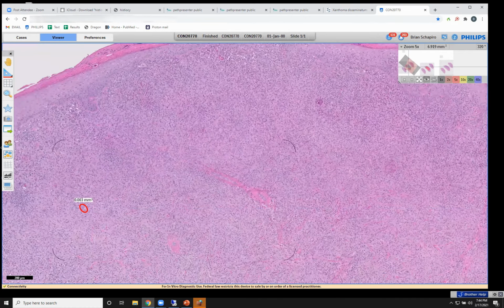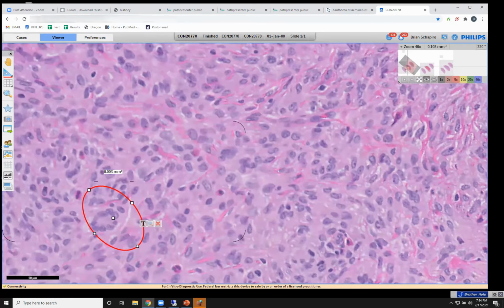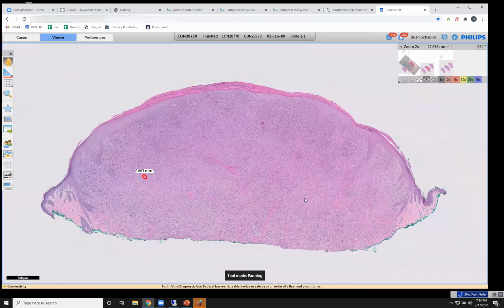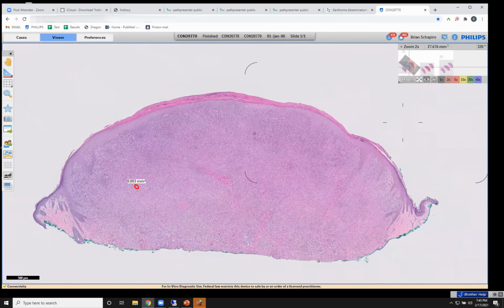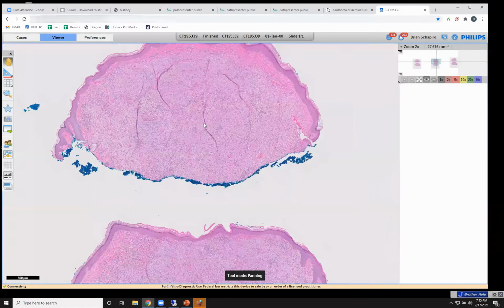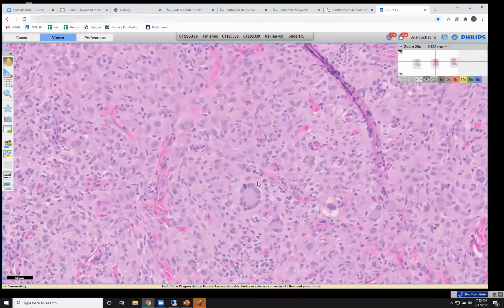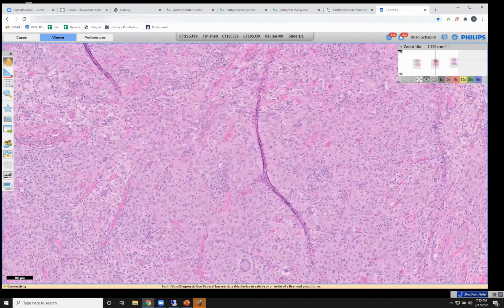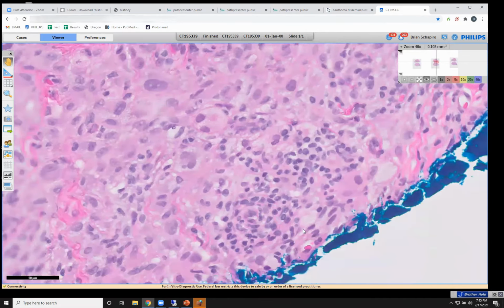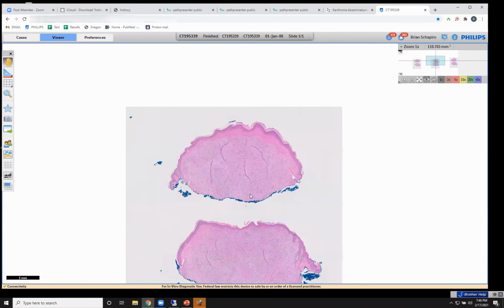That's why they put them in the same classification. There's another beautiful Touton giant cell, eosinophils, juvenile xanthogranuloma. And here's just a slide of another one, looks the same. And you can see once you get the hang of it, you just go straight to these cells. A few more of them, some lymphocytes, eosinophils, xanthogranuloma.